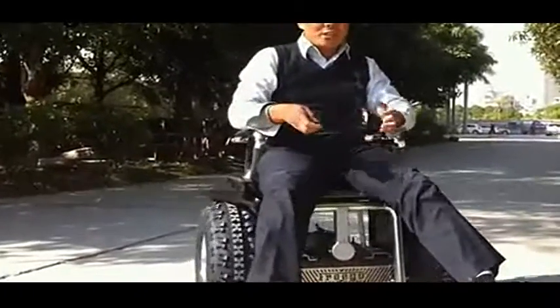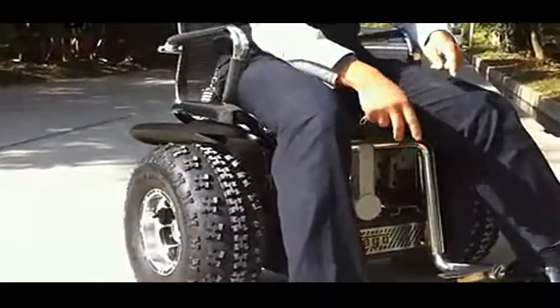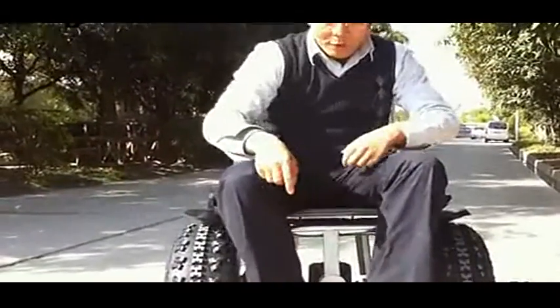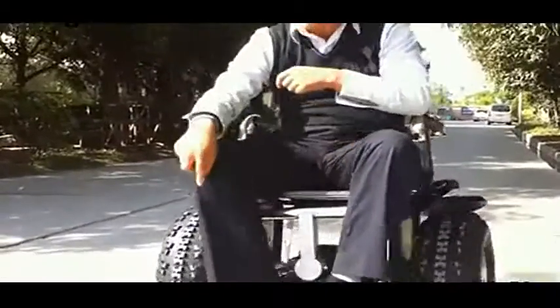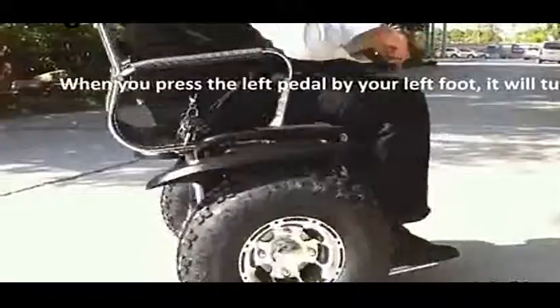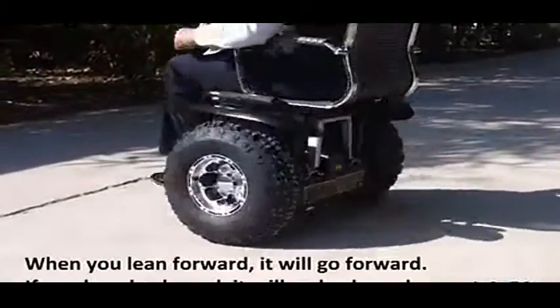There is one sensor for turning the direction here. Now we change it to the control by your two feet. One foot here. If I want to turn right, I press this here. I just press here.